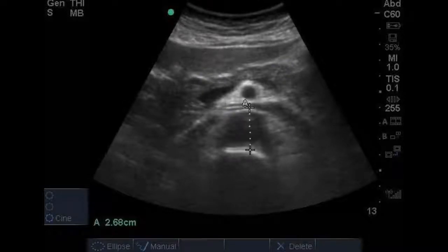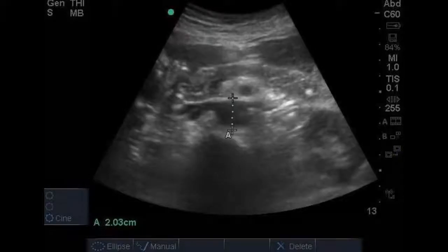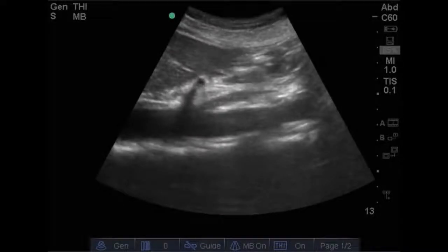And here is where we would measure the aorta, anterior wall to posterior wall, outer wall to outer wall, which gives you your mid-aorta measurement. Here's another view of measuring the mid-aorta, and you can see the SMA view right there as indicated by the arrow. Here we have a sagittal view of the abdominal aorta, and we can measure proximally to the celiac to measure proximal aorta, and we can measure distal to the SMA origin to get our mid-aorta somewhere like here.